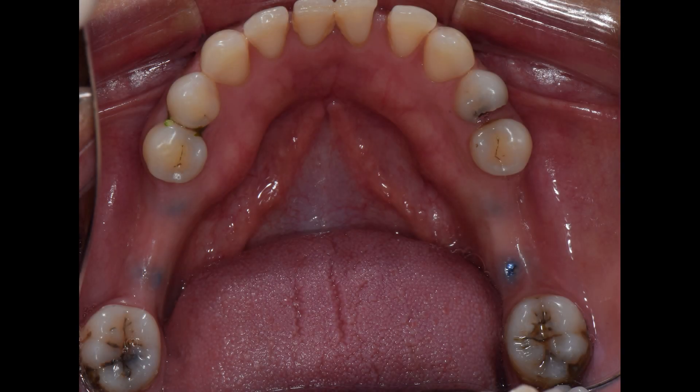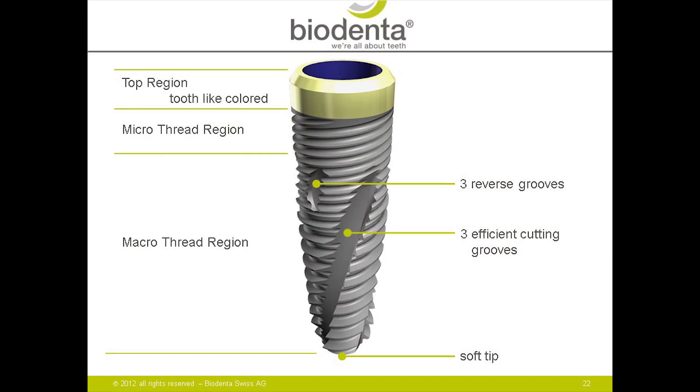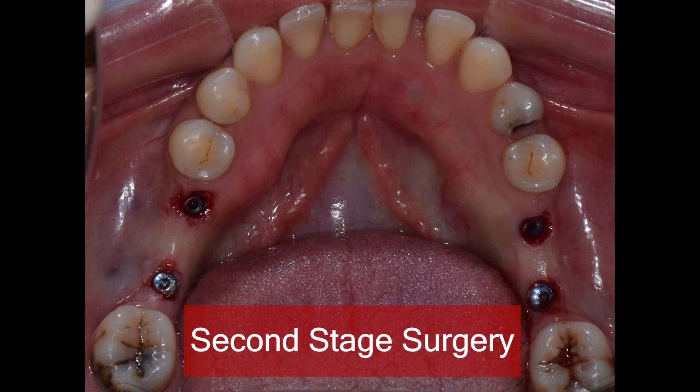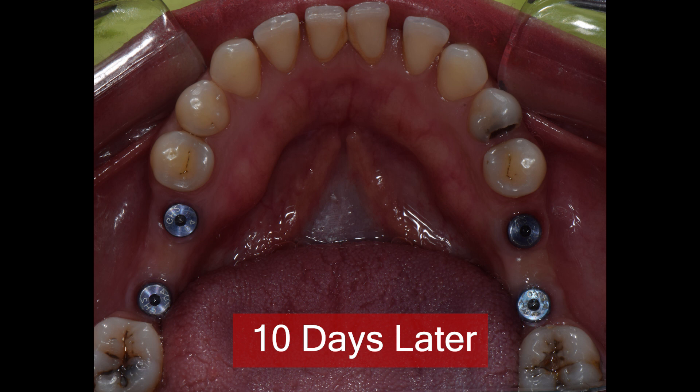These are Biodenta implants which were placed 3 months ago and now the patient is here to get the prosthetics done. Biodenta is a Swiss system which is extremely versatile, with a very easy protocol and extremely simple prosthetic options. As you can see, these are all B2 platforms and I have the healing abutments in place here.